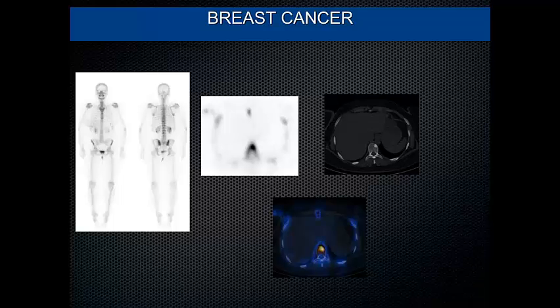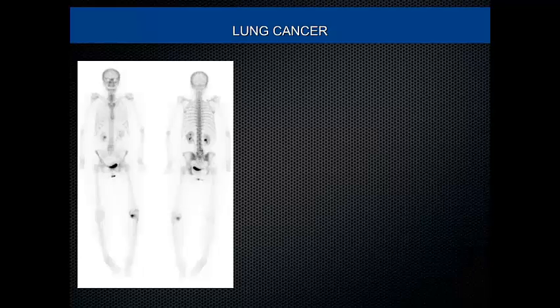Why is it definitive? Anyhow, they're going to pick it up in further imaging. But the problem is you have a one-stop imaging. So patient comes for a bone scan, you can always do a CT. If you say an equivocal scan, further radiological correlation, at least it takes a month for them to come back to the clinic and ask for a CT and further correlative imaging. Everything changes because we work in a government sector, it's the NHS, there is a huge waiting list. So if you have a one-stop imaging, it really helps to clarify benign and malignant disease.